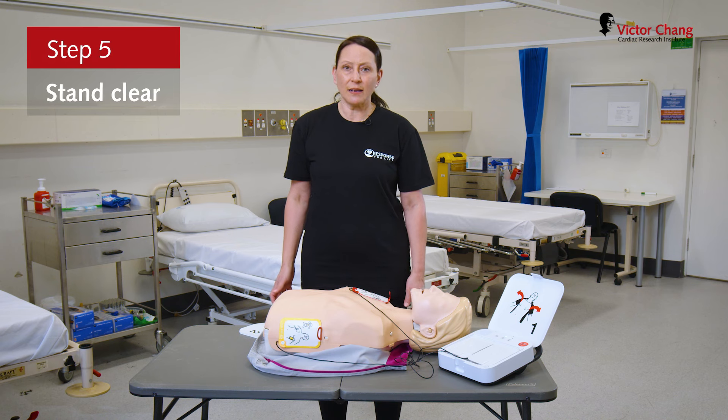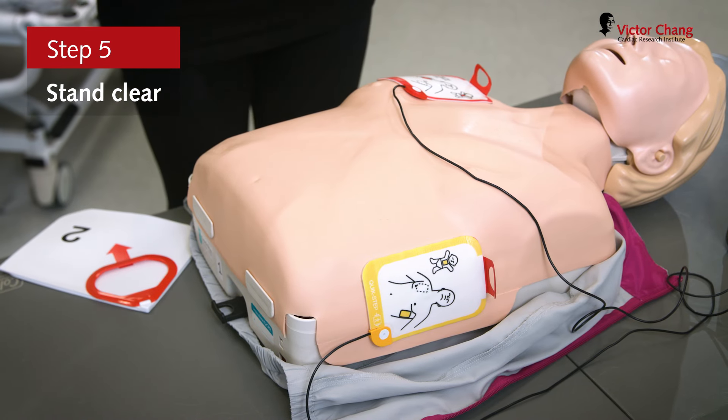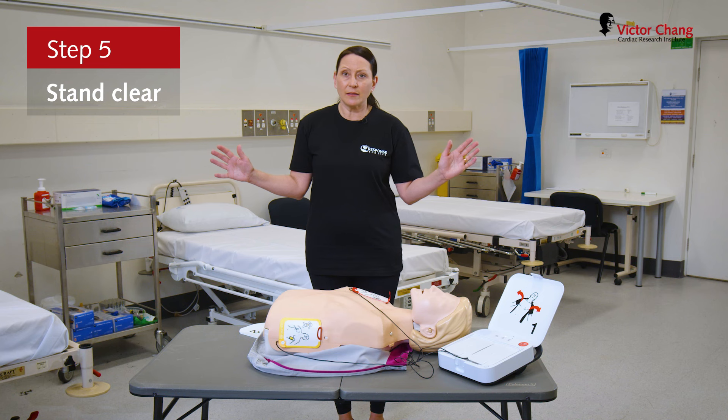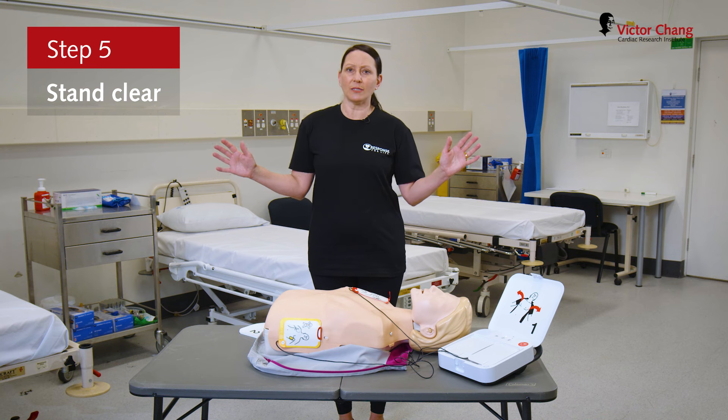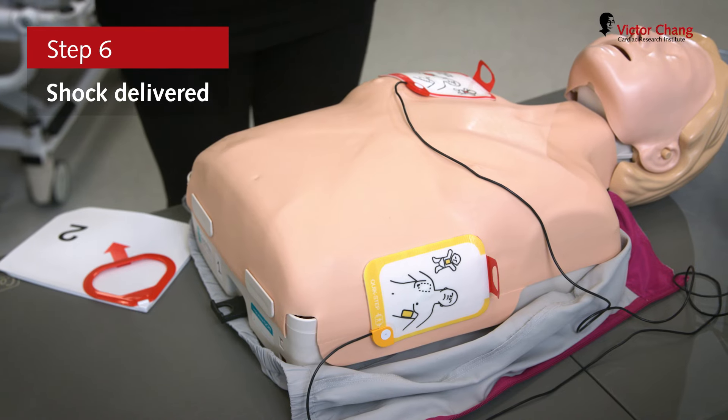The defib will advise us to stand clear and will advise that a shock is being delivered. Step back from the patient and keep your hands in the air — that way we're letting any bystanders know do not touch. The defib will then deliver the shock.